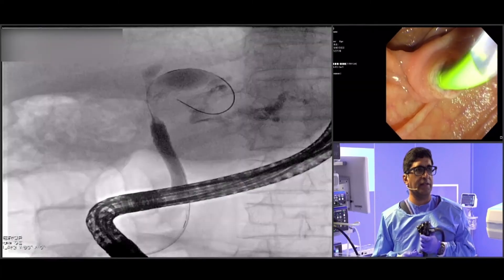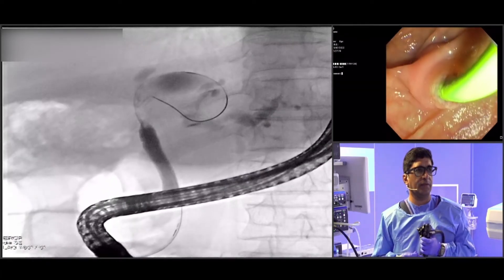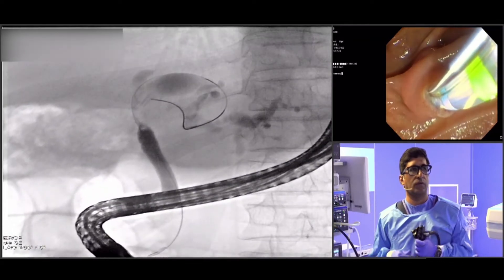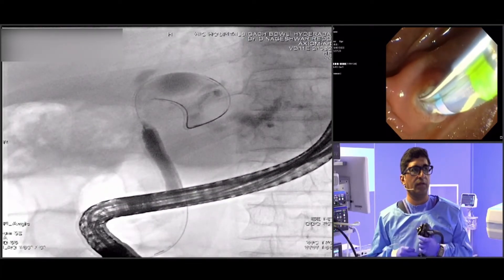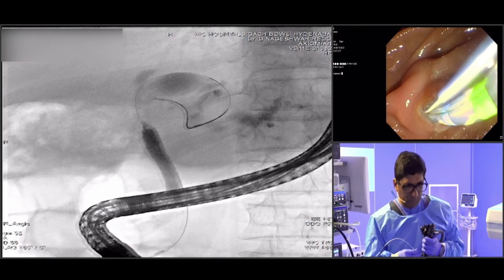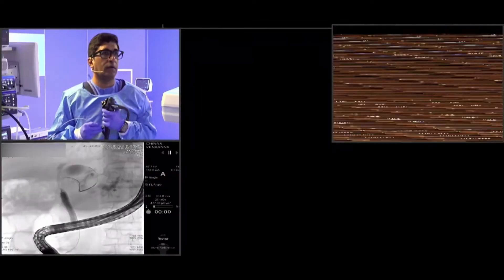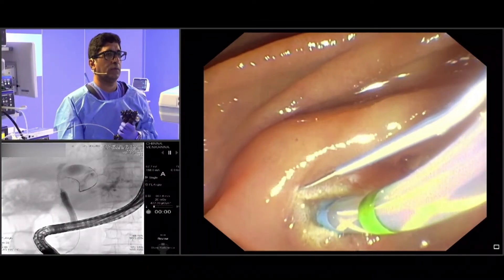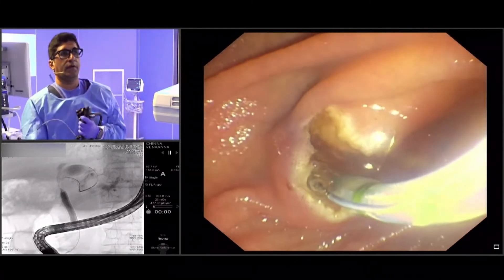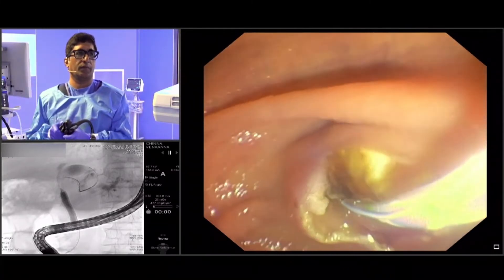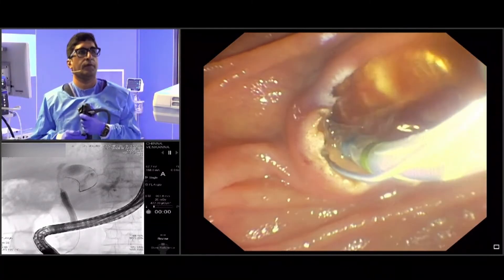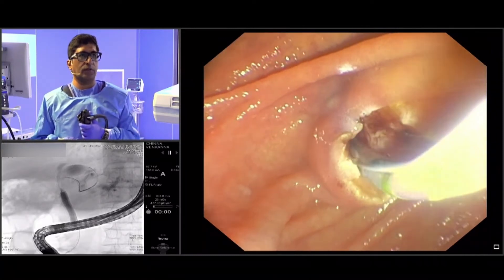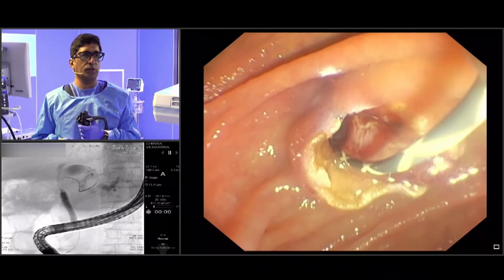Now we have defined the stricture — it is involving the confluence — so we will do a sphincterotomy. We have now done enough sphincterotomy, and our aim is to proceed to tissue sampling.